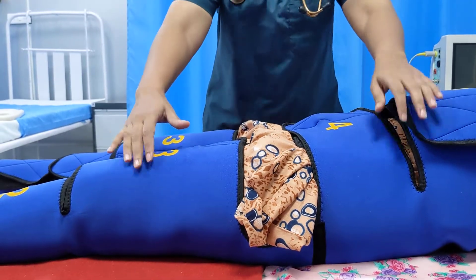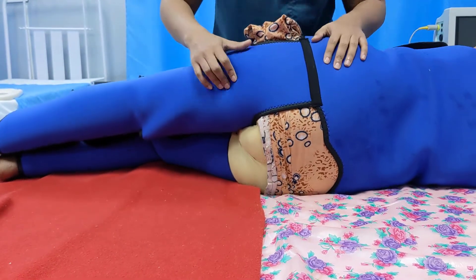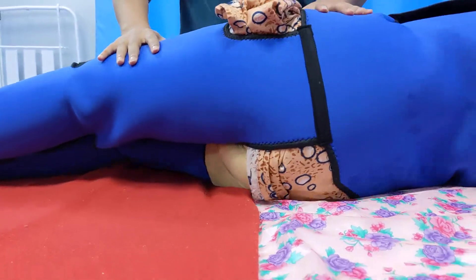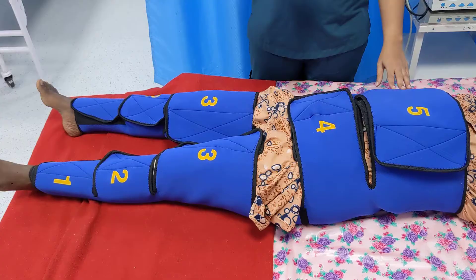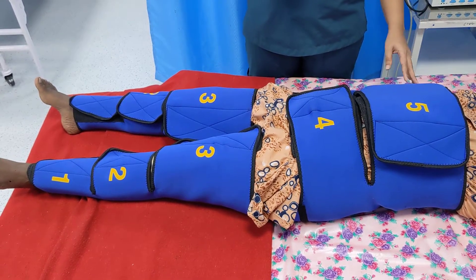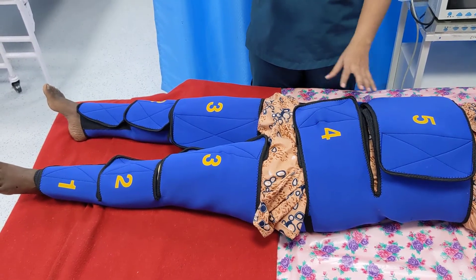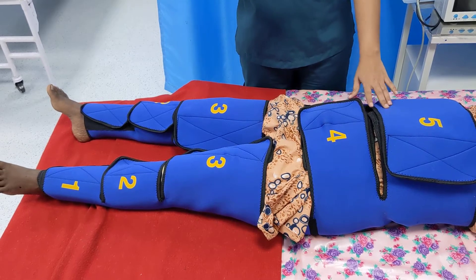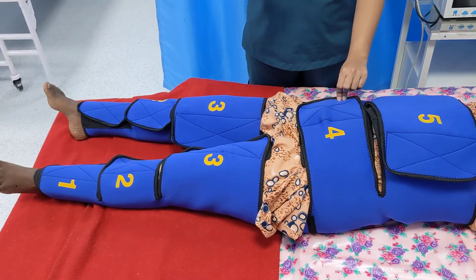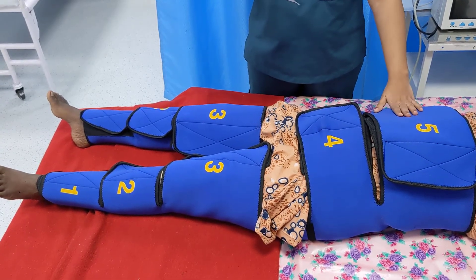Another advantage is that if the patient needs to pass stools, the entire garment need not be removed — there is a cut section at the back where a bedpan can be placed. Since this garment is reusable, it should be cleaned under normal running water after each use, washing away all blood clots and stains. It is then placed in a sodium hypochlorite solution for 20 minutes, sun-dried, and stored in a clean and dry place before reuse.